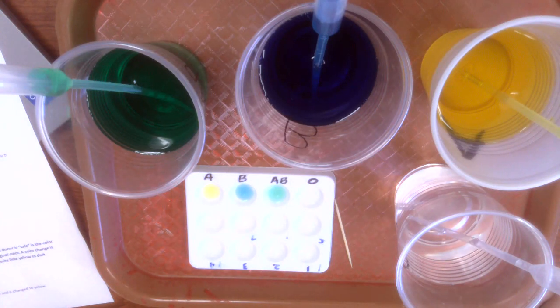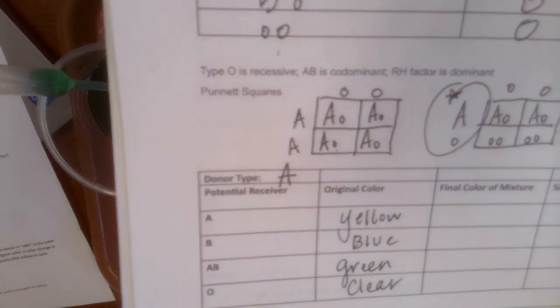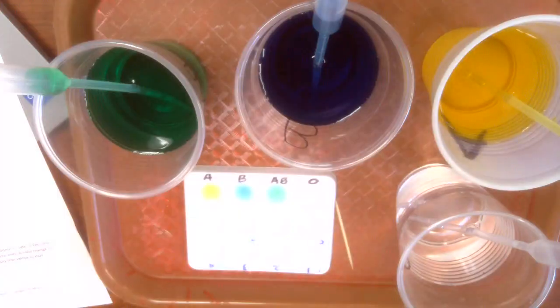So you could even go and fill those out like this. You have the original colors, yellow, blue, green, and clear. Final color, and then safe or unsafe.